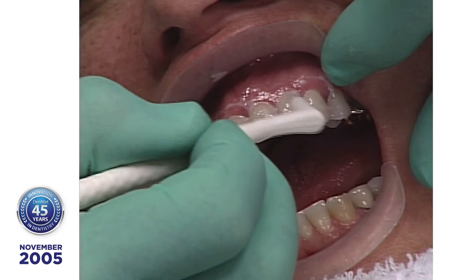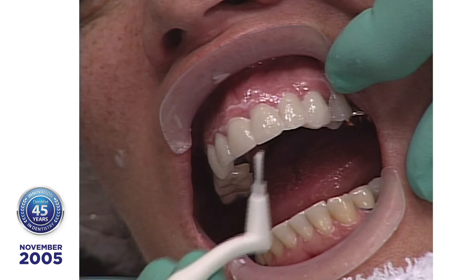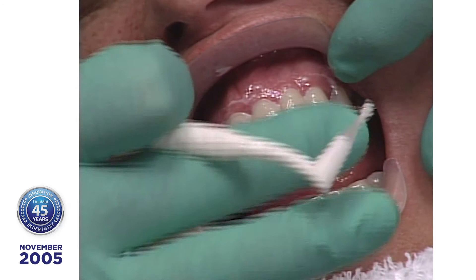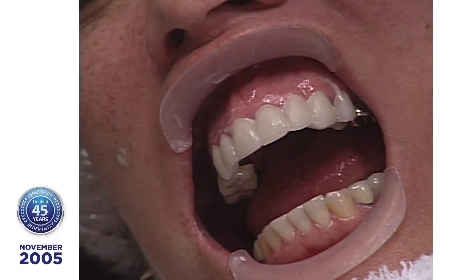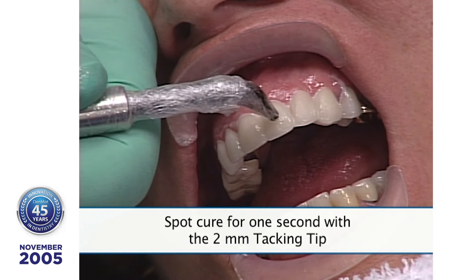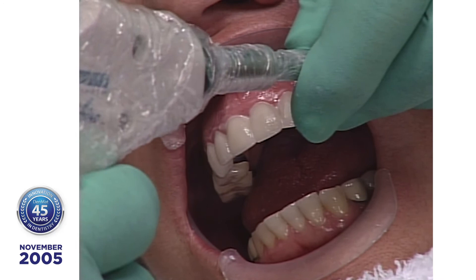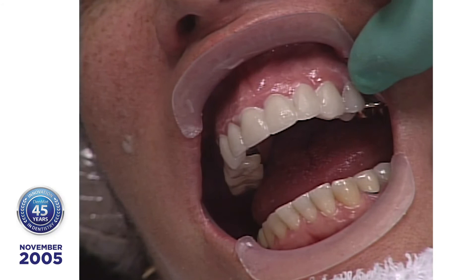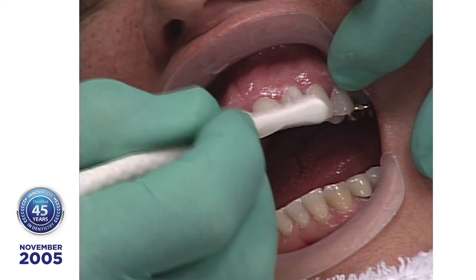People ask when I'm going to retire, and I say: what could be easier than a little brush, a little resin, a little luminaire on the teeth? Lisa used to work for dentists who did traditional prep, where the patient would get out of the chair tired and just glad to get out of there. Now I can halfway relax — we're off the runway but I don't have the wheels up yet. We can take some of this out in between and check the lingual side.